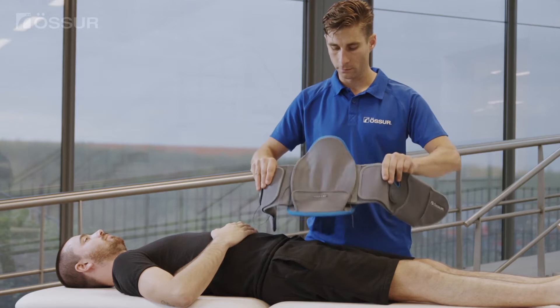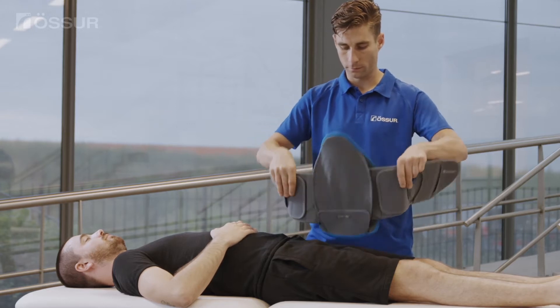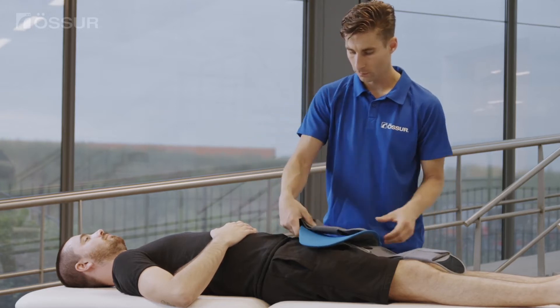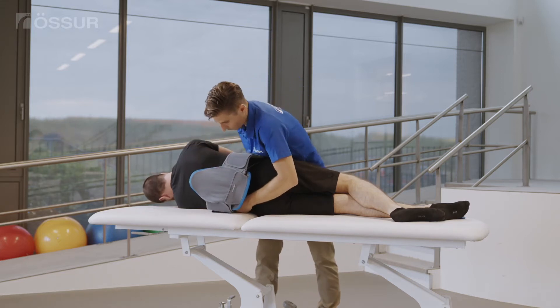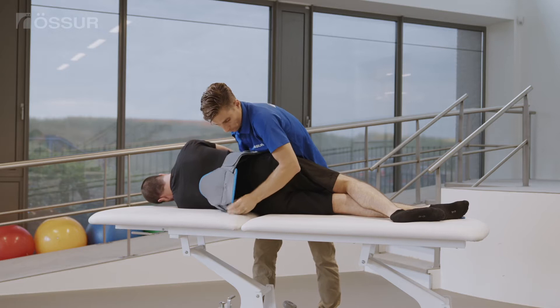Ensure the belt compression system is stretched to its full width and reposition the compression system handles onto the belt arms. Ensure that correct spinal protocol is followed throughout the application.